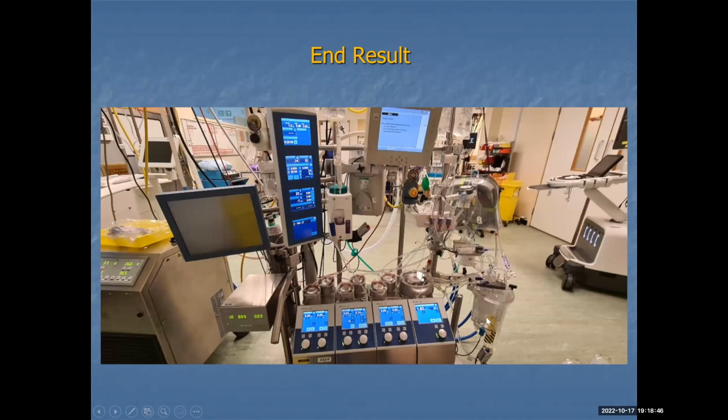If we had this in theatre and we had our fluid running, what you would see was fluid taken from the reservoir being pumped around the pump here. Remember, this is our heart, into the oxygenator and at the back. That would then come around into the tubing around the back there, which is the lines that will be handed up to the operating table and connected to the patient eventually. So this would be turning. You can see a flow rate of 1.82 litres, and you would see the fluid moving. It's very difficult to show clear fluid moving around a circuit on a video because you can't really tell the direction. But I've got another picture later with blood in it, so hopefully that will help.